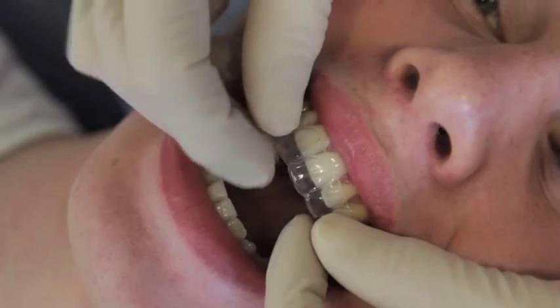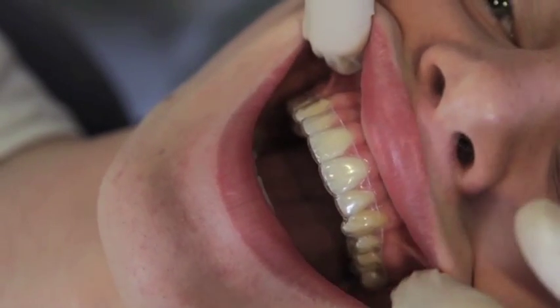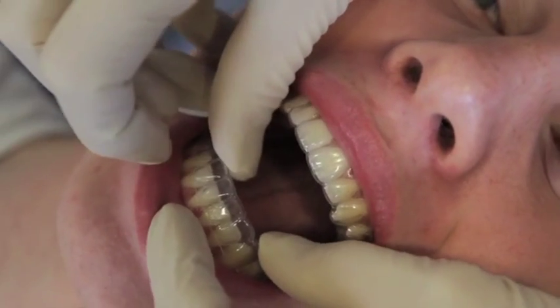The fitting of a retainer is a very simple process and here you can see some new retainers that we're just fitting. Sometimes it can feel a bit tight — don't worry about that, this will ease up over the first few days.